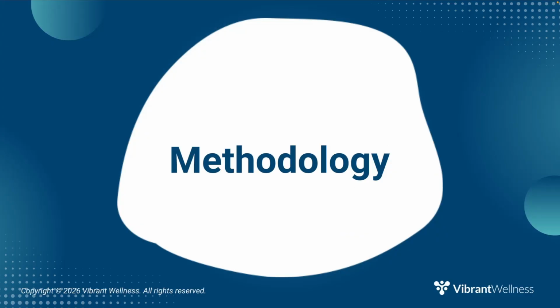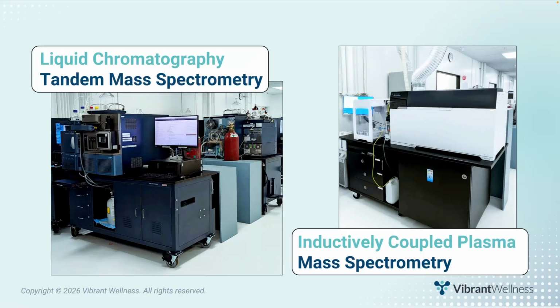Now let's talk about methodology. Vibrant's Nutrient Zoomer utilizes the gold standard inductively coupled plasma mass spectrometry, abbreviated ICP-MS, for metals and minerals, and liquid chromatography with tandem mass spectrometry methodology, abbreviated LC-MS, for quantitative detection of most other micronutrient markers. These methodologies are powerful analytical techniques that combine the separating power of ICP or LC with the highly sensitive and selective mass analysis capability of triple-quadrupole mass spectrometry.